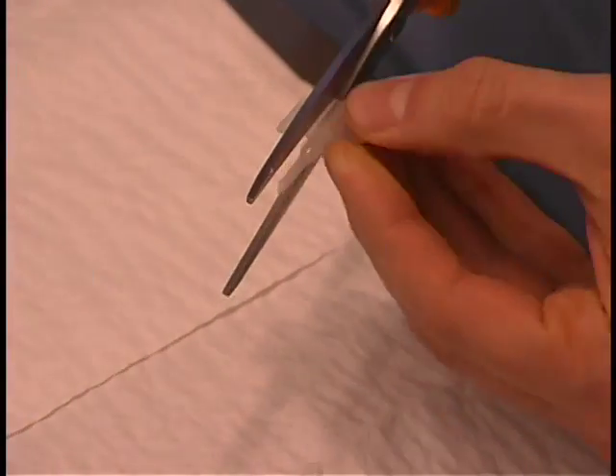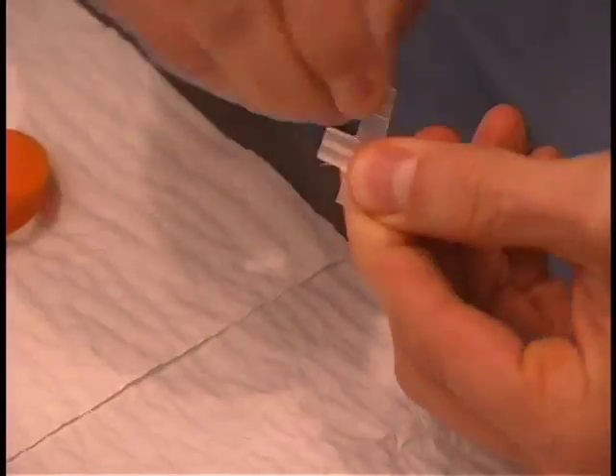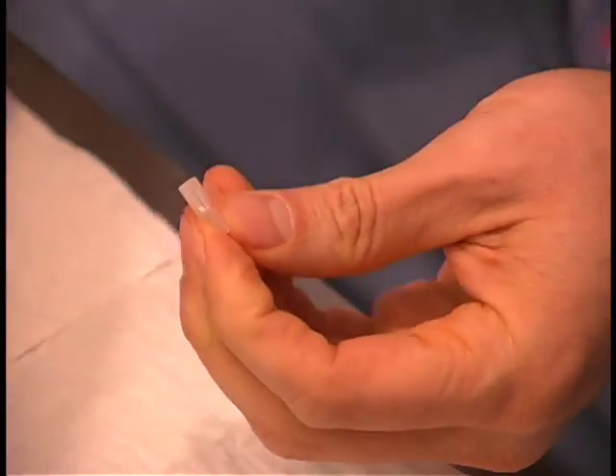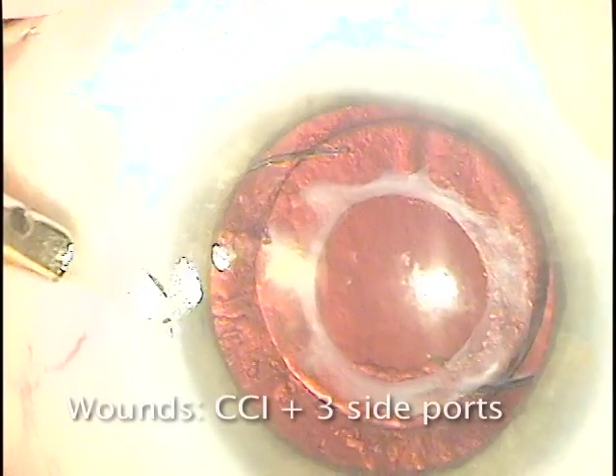We'll put together a simple injection system of readily available materials as shown here. We'll cut off part of the wings of each side of the cartridge so it will fit in our tubing.